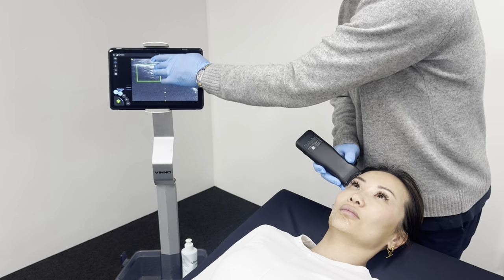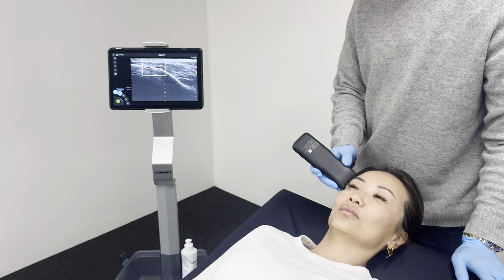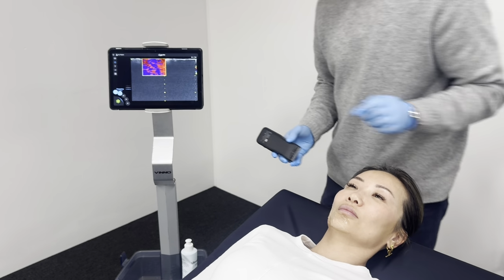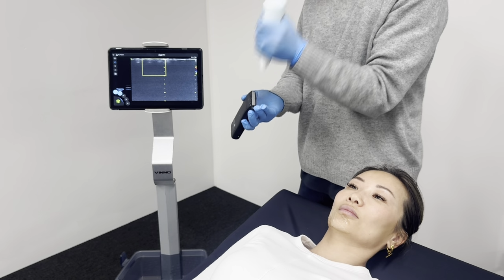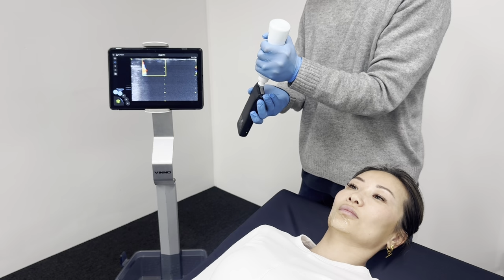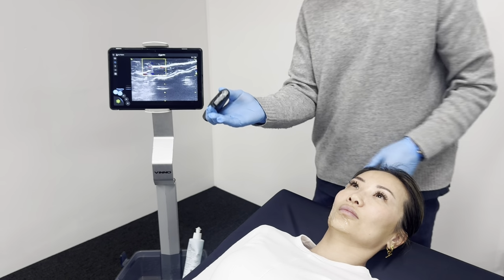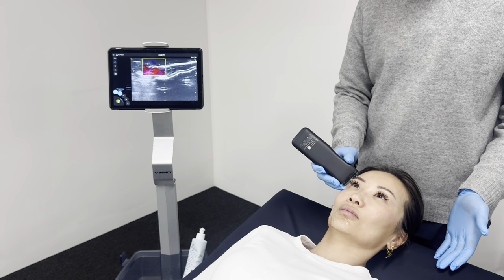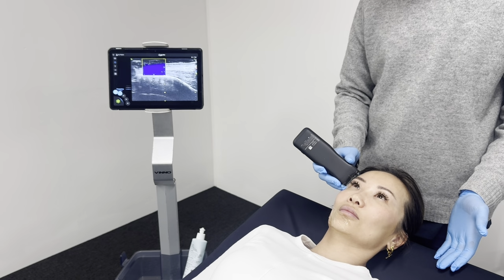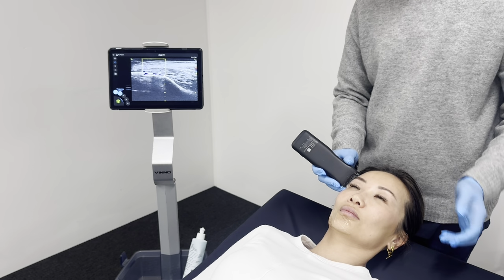Let's have a look and see if we can see that superficial temporal artery as well. So the superficial temporal artery will always sit above the superficial temporal fascia. Sometimes you need a little bit of a gel standoff. It's very handy on the linear handheld probes if you can have a nice little gel standoff like that. Make sure you hold the probe down the end here, so you can even have it so that the probe isn't even contacting the skin. It's just sitting above, and that gives you a nice standoff to be able to see.